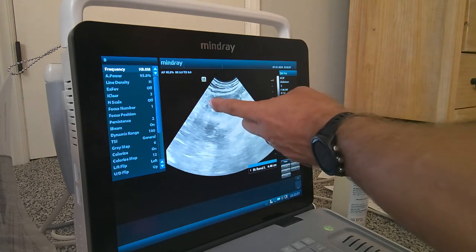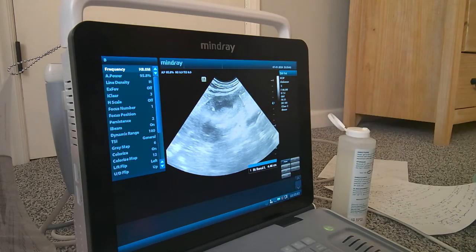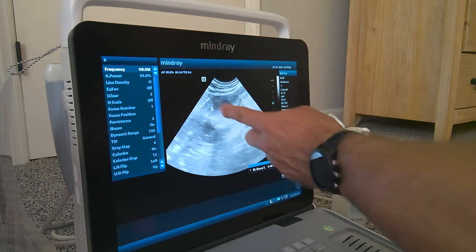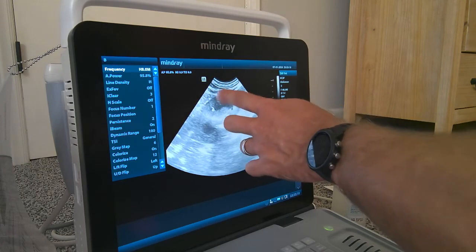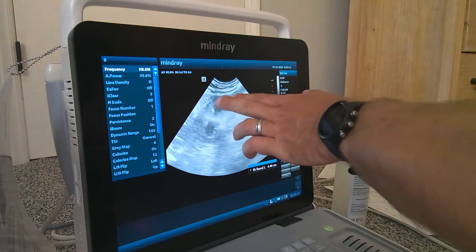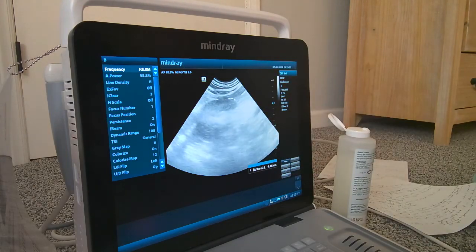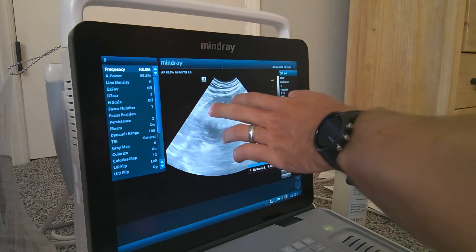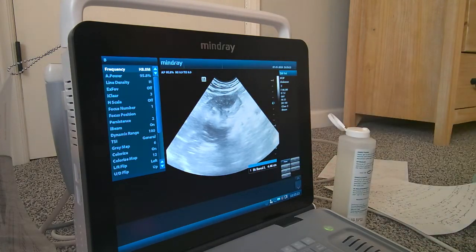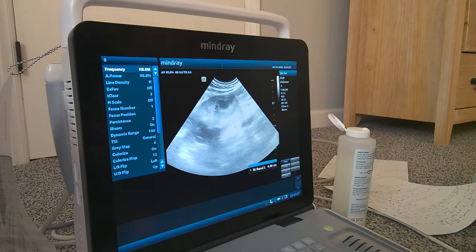If we're seeing any infarcts, a lot of times that fibrosed cortical tissue will look hyperechoic and sometimes even be in a pyramidal shape along the cortex. That happens because it might have been one of these arcuate vessels blocking off the blood supply to that one area within the cortex, and that can shrink it down a little bit and make it hyperechoic. So we can look for changes like that. We can look for calculus or mineralization within the cortex. That's kind of common, especially with degenerative changes.